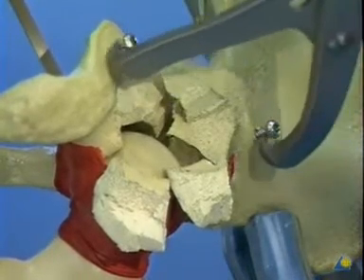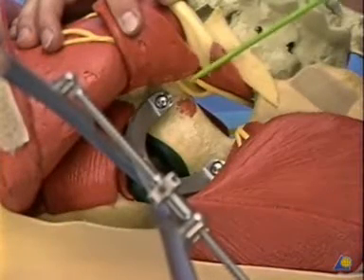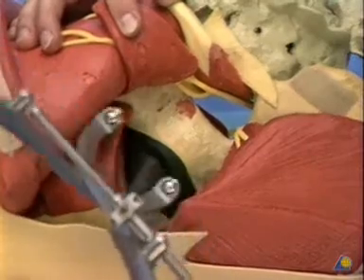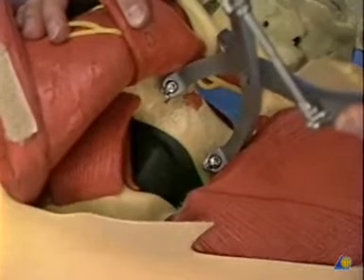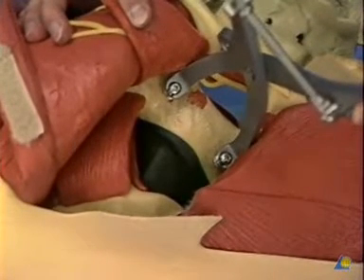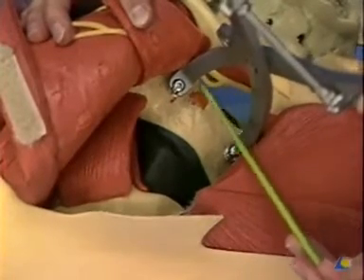The reduction forceps are attached to the screws. The correct orientation of the reduction forceps prevents a stretch injury to the sciatic nerve. If the forceps are placed in the opposite manner, a stretch injury to the sciatic nerve can occur. However, we'll use this orientation for the video in order to increase visualization.